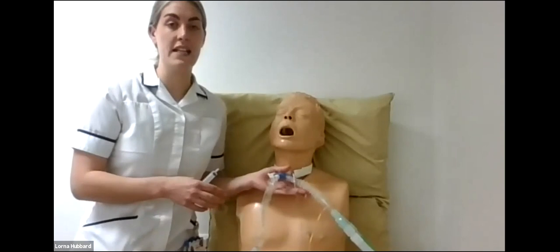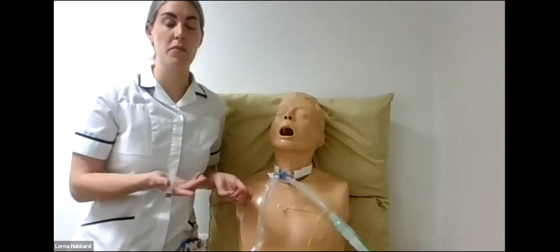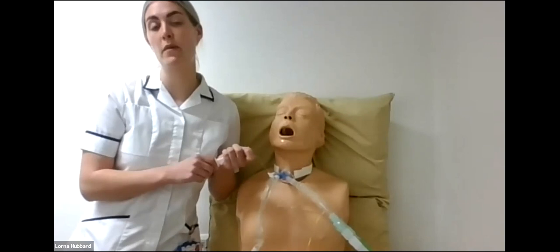If the patient is on a ventilator in an invasive mode, when the cuff comes down there's going to be a big leak in the system with a lot of air escaping out of the nose and mouth - the ventilator should start to alarm. In this case it's actually a positive sign because we want to know that the ventilator detects a big leak - that's what we're trying to achieve. At that point we often switch to non-invasive mode so the ventilator is a bit happier. Separate videos will be put on YouTube showing how to swap the modes over and what you might see when you drop the cuff.